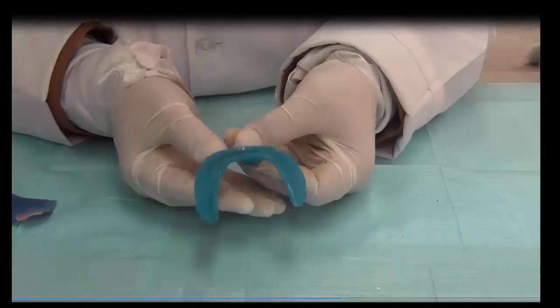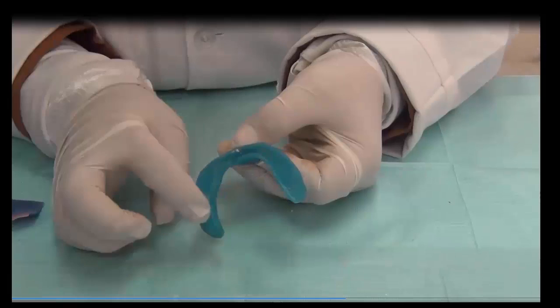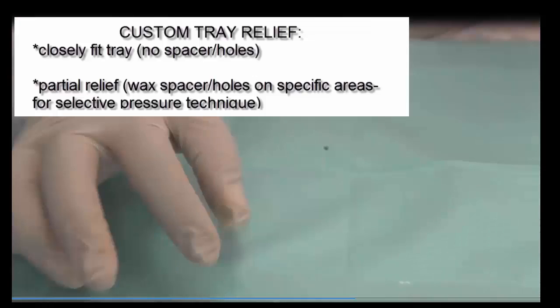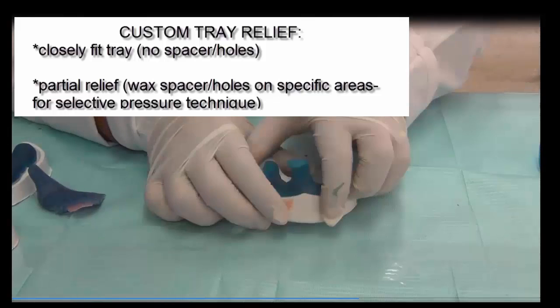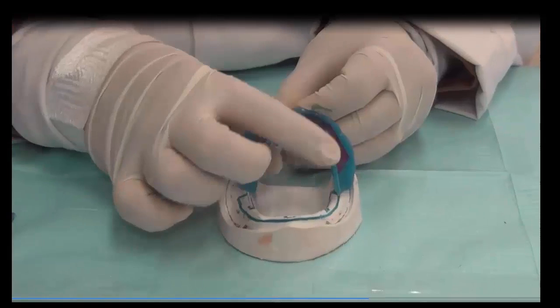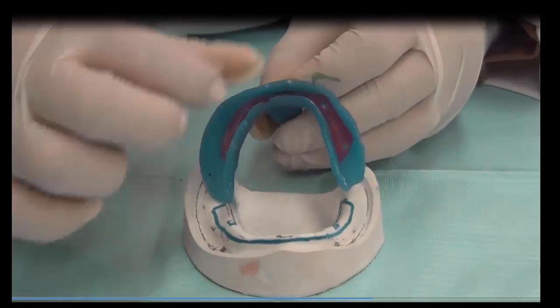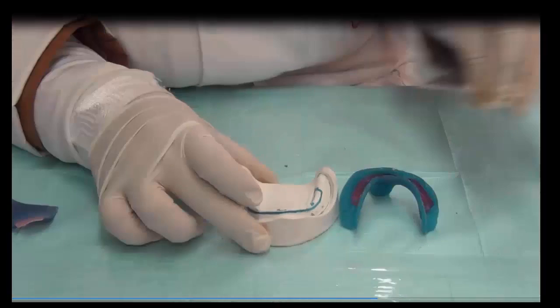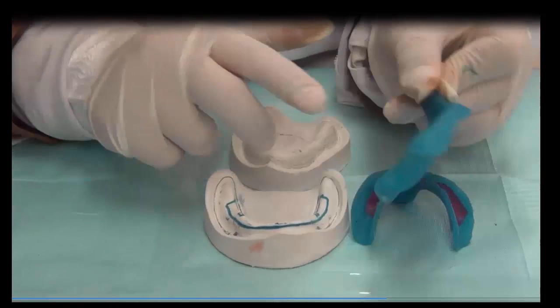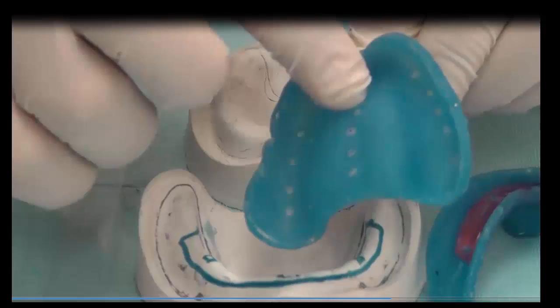On the inside of the trays, we have multiple ways. We could have trays with empty areas, nothing there. This is called closely fit tray. We could have trays with relief, which is wax placed inside, and this is called wax relief. And we have trays that have perforations instead of the wax. This is what we see from the inside.